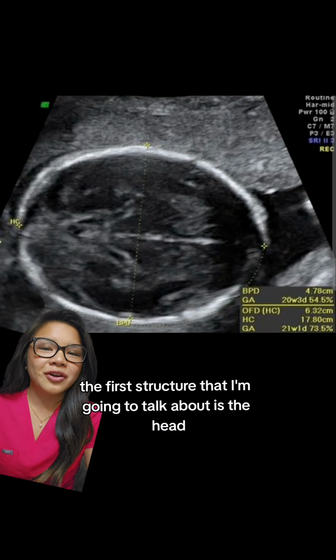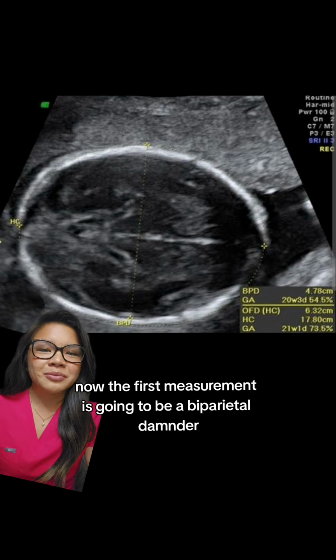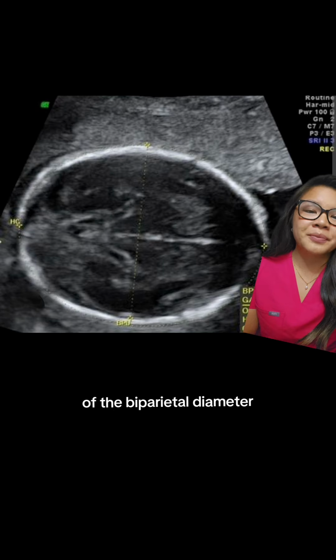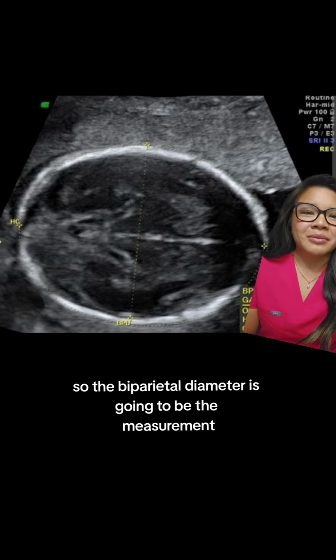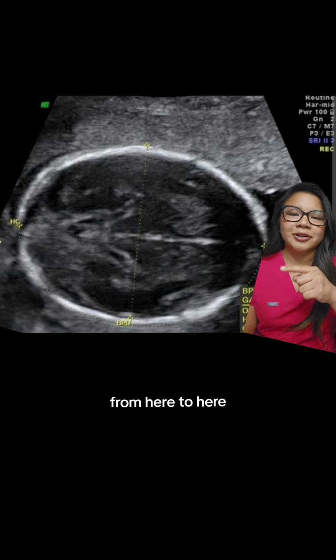The first structure that I'm going to talk about is the head, and this is where we get 2 measurements off of the head that again contribute to us determining how much baby weighs. Now, the first measurement is going to be a biparietal diameter. What this means is we need to be in a very specific spot in baby's head where the brain structures are in order to take our measurements of the biparietal diameter as well as the head circumference. So the biparietal diameter is going to be the measurement from one end of baby's head up here to the other end. It's just a single measurement, so basically from here to here.